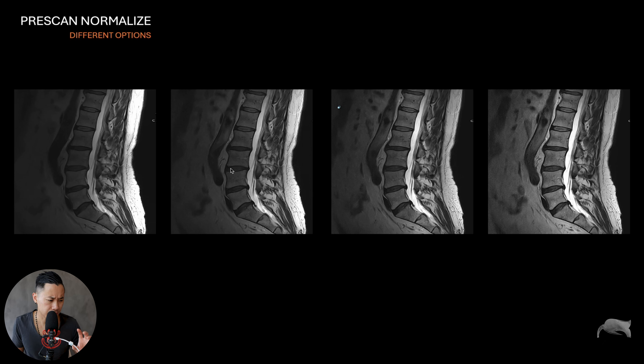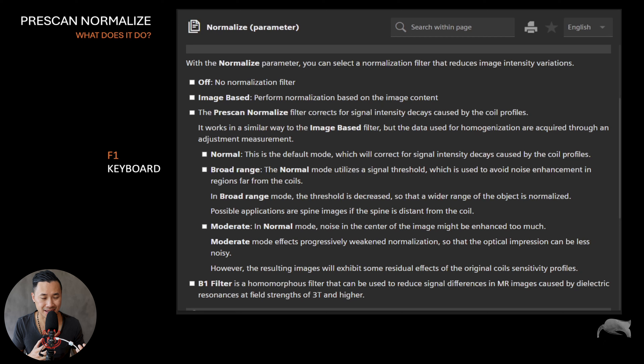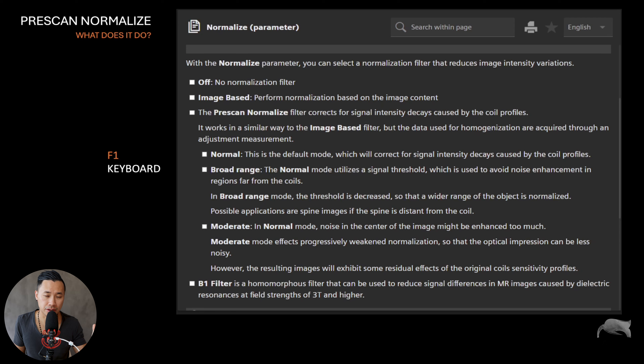Whenever you're on a scanner and have parameters you don't understand, you can just push F1 on the keyboard to get a little handbook for further understanding. With pre-scan normalize, you can select a normalization filter that reduces image intensity variation. This is exactly what we see going from off to on — whenever the anatomy is near the coil it's very bright, and further away from the coil it gets darker. We want the image to be as homogeneous as possible.